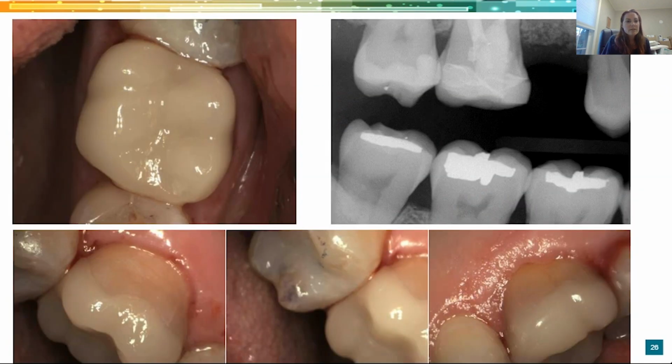And then here are the finals. Again, the patient did have a root canal. He eventually ended up losing tooth number 4. He fractured a virgin tooth. So this person is definitely a very heavy grinder, and I'm still very comfortable putting a ceramic restoration in this. As long as you have really good clearance and thickness of your restoration, you're fine.